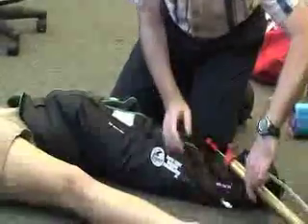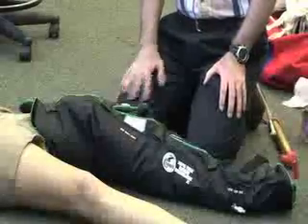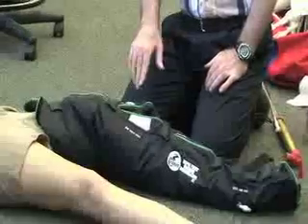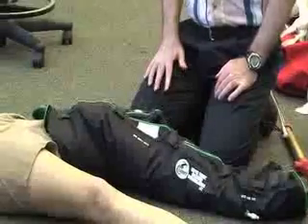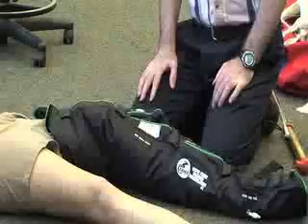Once we have her in this position, we can put her on a backboard and transport her. One of the things you want to make sure is that the emergency room or the paramedics do not cut this piece of equipment. Hopefully your address and stuff is written on it so that you get it returned.